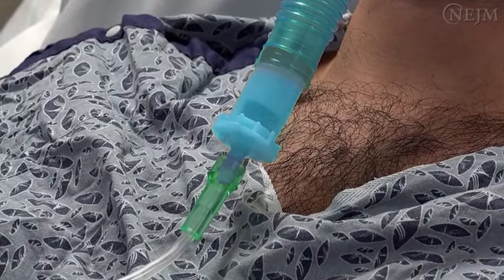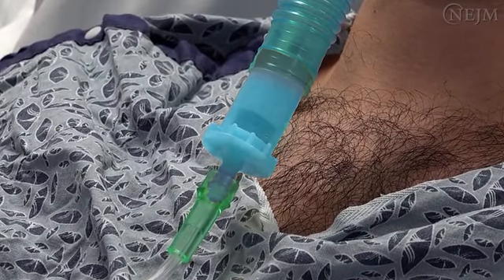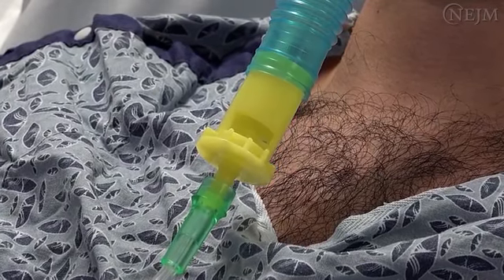The color coding in a Venturi mask can vary across manufacturers, so extra attention may be needed to set the correct oxygen flow for each of the air entrainment devices. The delivery of supplemental oxygen through a nasal cannula or face mask can be inefficient because of flow limitations, particularly in patients with a high inspiratory flow or high minute ventilation.